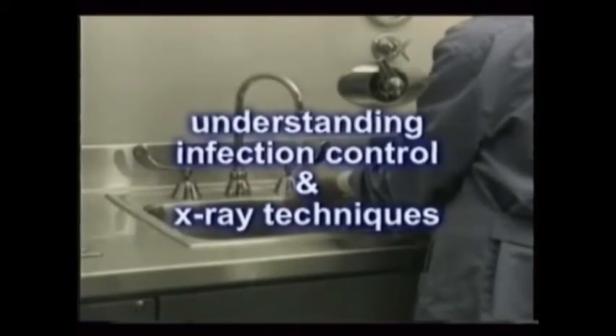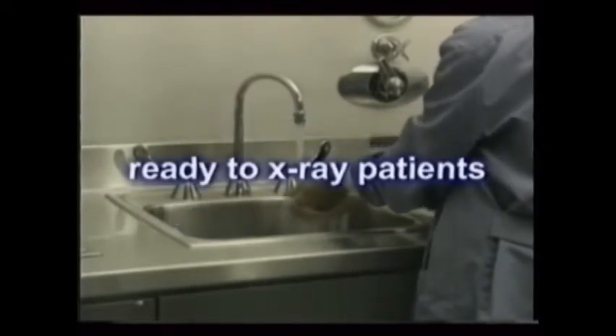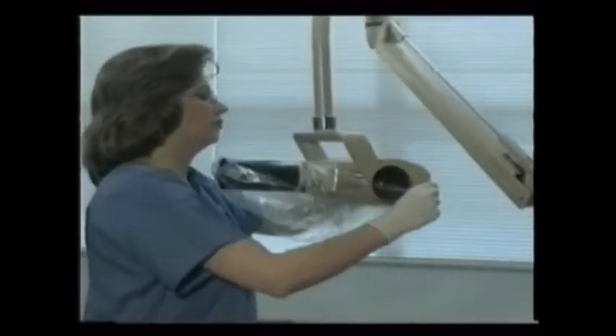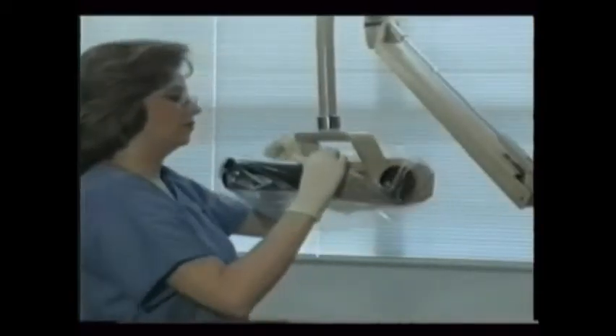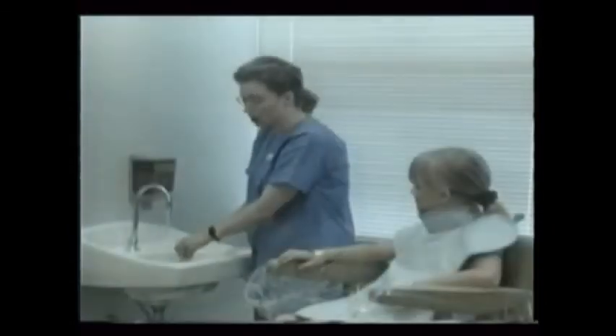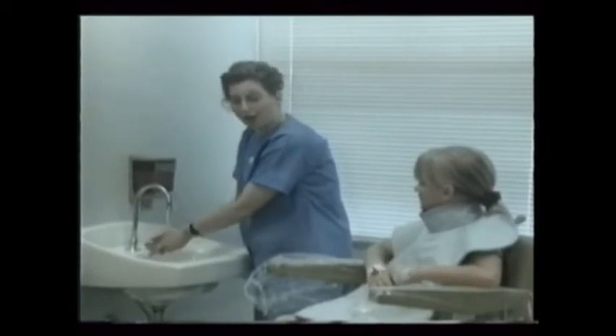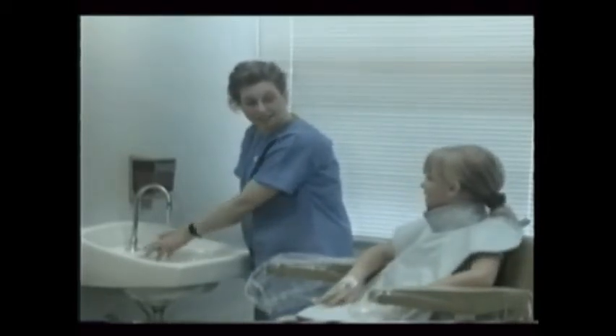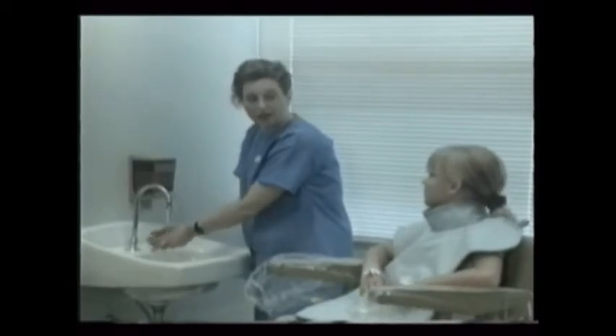With a clear understanding of proper infection control and x-ray techniques, you're ready to expose patients to x-ray. Intraoral x-ray exams are usually performed in a treatment room equipped with an x-ray machine. The room should be properly disinfected and draped prior to seating the patient. After draping the patient with a lead apron, wash your hands and put on the appropriate personal protective equipment — the mask, safety glasses, and gloves.